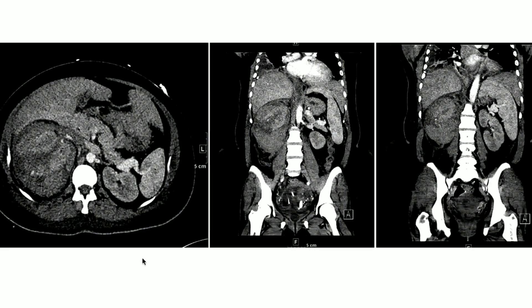I can also appreciate a focus in the lateral aspect of the right renal parenchyma on the axial image. Part of the renal parenchyma is not enhancing — mostly the cortical area — suggesting some element of cortical necrosis.